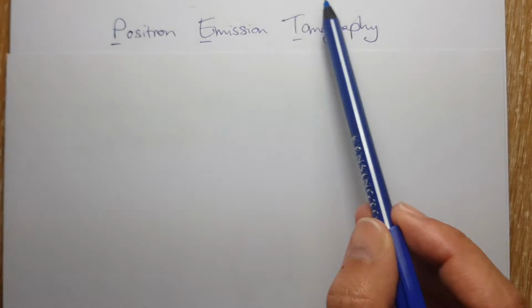PET stands for positron emission tomography. You don't need to remember that, and tomography is just a fancy word for picture. Remember that these scans are all about imaging what's inside the body.